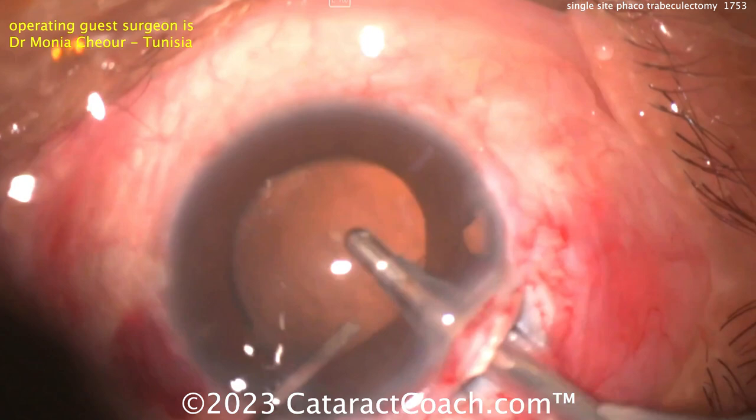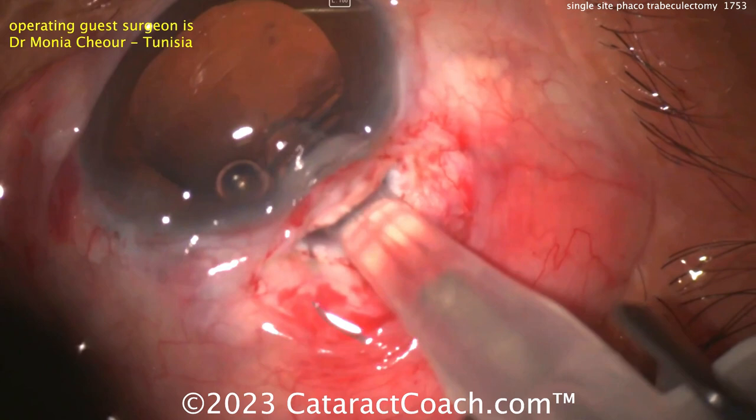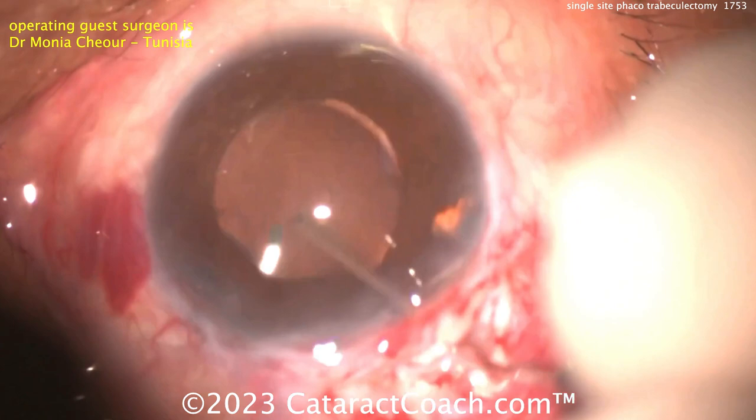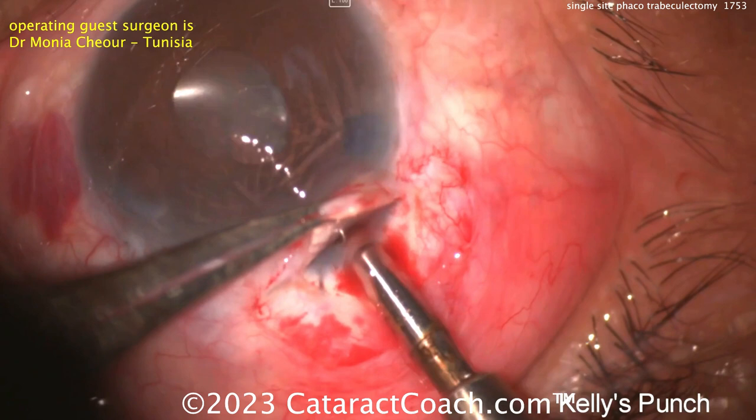Obviously in a case like this, I think the smart choice tends to be a monofocal lens. These patients obviously have compromised posterior segments with nerve fiber layer issues and optic nerve issues. Here comes the lens — looks like a single-piece monofocal acrylic lens going inside the capsule bag very nicely. Get that positioned and opened up in the bag. Looks like beautiful rhexis overlap. Looks like a tiny eye, so maybe a hyperopic eye. Washing out the viscoelastic probably.